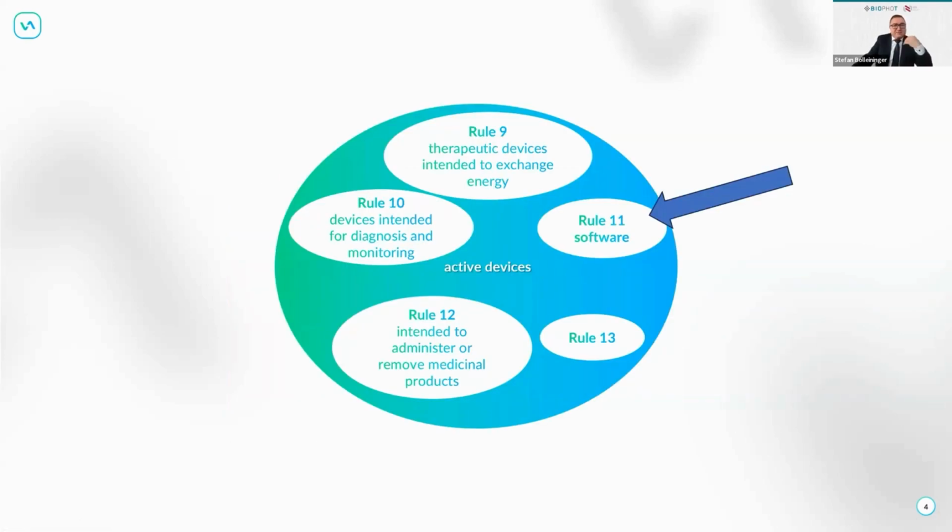Prior to MDR, when we had the MDD from 1993 up to 2017, there was no Rule 11. So software was not covered directly or as its own. However, software was implicitly covered by Rule 9, Rule 10, Rule 12, which was former Rule 11, and Rule 13, which was former Rule 12.